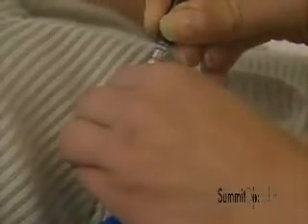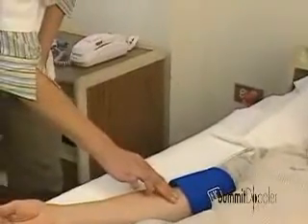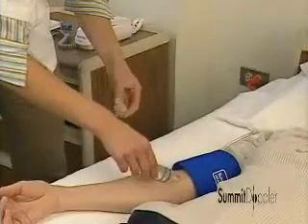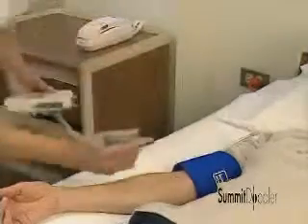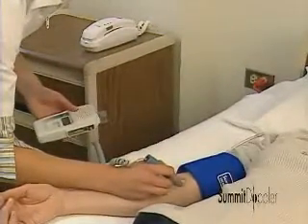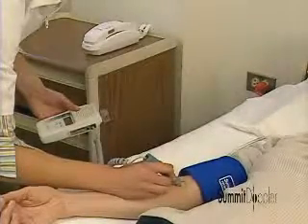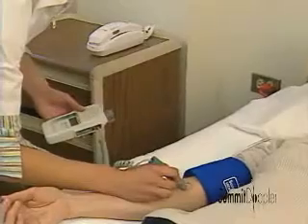Prepare the cuffs for use by plugging the hose into the aneroid. Plug the other end into the cuff prior to use. The arm pressure is taken at the brachial artery. Here we'll start at the right arm. Apply gel over the brachial artery. Position the LifeDop probe on the site at 45 degrees with respect to the artery and pointed toward the incoming blood flow, in the general direction of the shoulder.